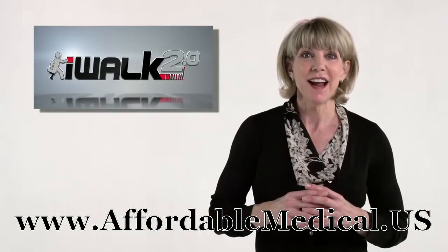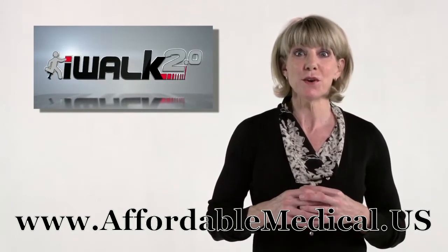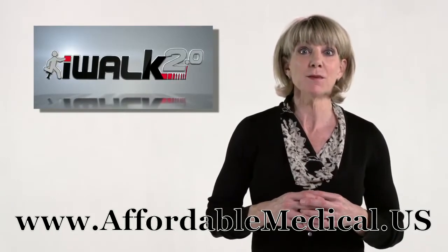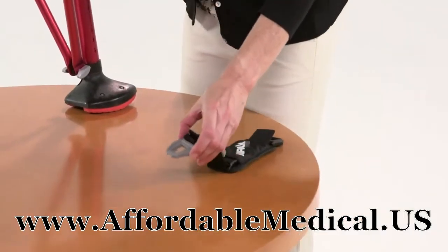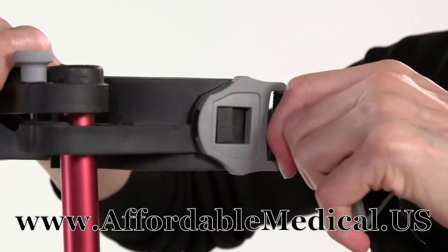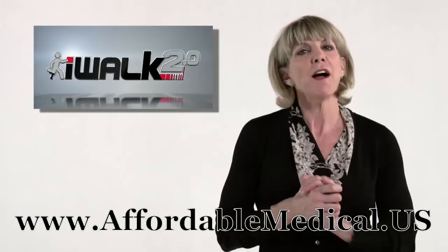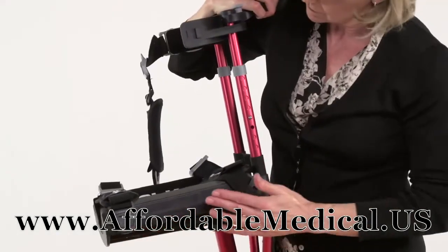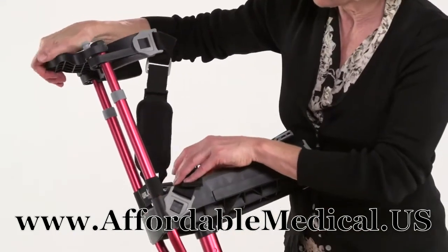And the last step: installing the straps. The first two are already installed on the knee platform and the last one goes on the thigh supports. All you do is line up the T-lock buckle of the strap with the T-post on the crotch, slip it on, pull it back and you're done! By the way, the black buckle belongs on the inside of your leg and the grey one goes to the outside.